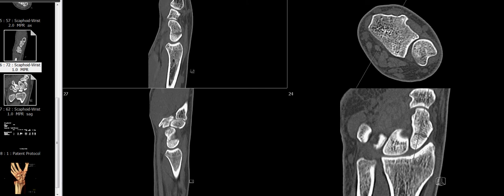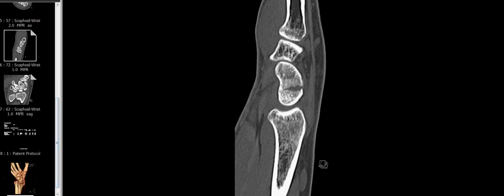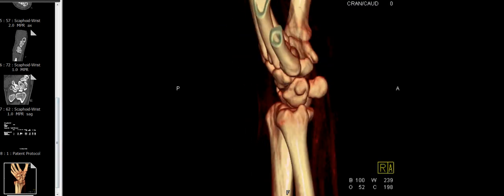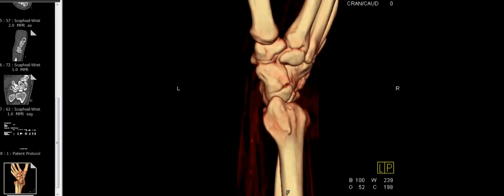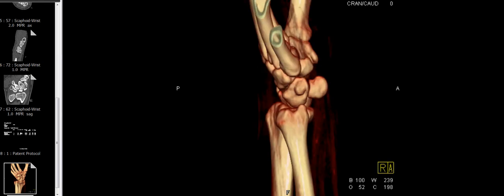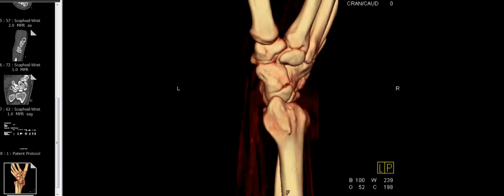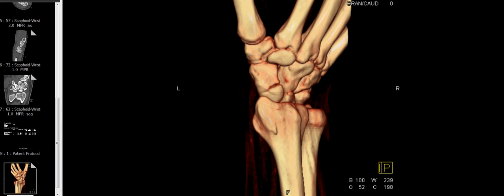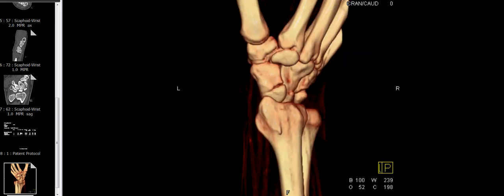You can see the scaphoid almost in its entirety on a single slice, and that's what we're looking for — and that's what the surgeons are looking for. That was well done. In addition, the surgeon asked for 3D volume rendered images, and here's nicely done volume rendering. They're looking for the scaphoid morphology. In theory you could remove the radius or even the other carpal bones and just focus on the scaphoid, but in this case it's well seen. Good job.